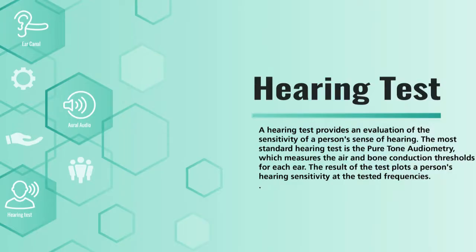Once those results are acquired, then we will ask you to actually repeat a couple of words back. We'll ask you to say ice cream, baseball, hot dog. I know, are you getting hungry? So am I. After those words are taken, those are to make sure that your pure tones, meaning the little tones that you heard in your ear and you press the button, no more raising hands, we've evolved, are matching what you're actually hearing, the smallest level that you can understand words.